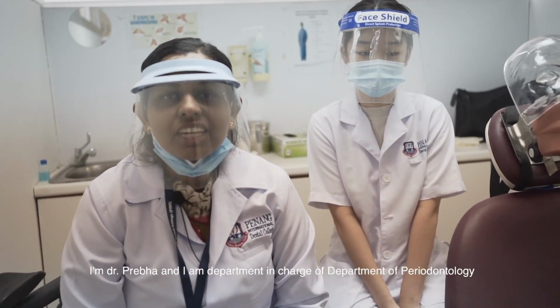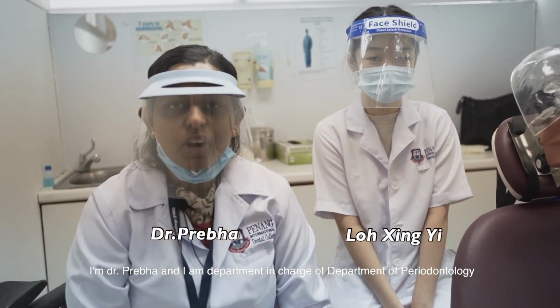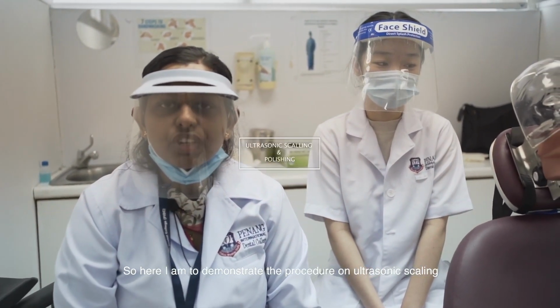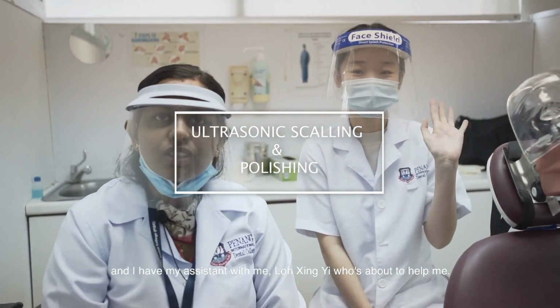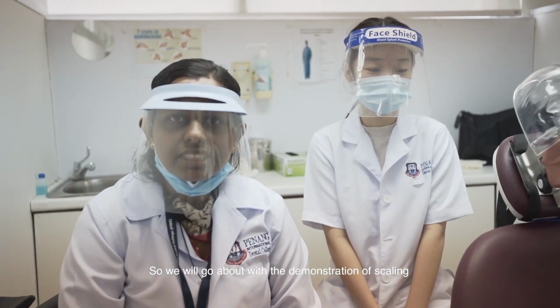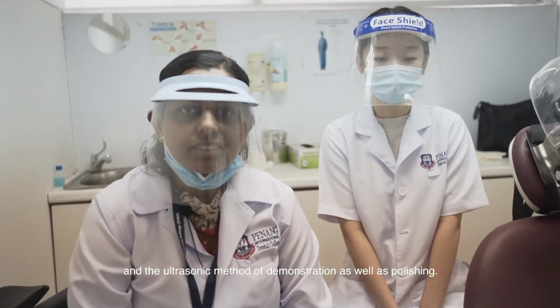Hello, good afternoon. I'm Dr. Prabha and I'm in charge of the Department of Periodontology. Here I am to demonstrate a procedure on ultrasonic scaling, and I have my assistant with me, Ms. Lojingi, who's about to help me. So we'll go about with the demonstration of scaling in the ultrasonic method as well as polishing.